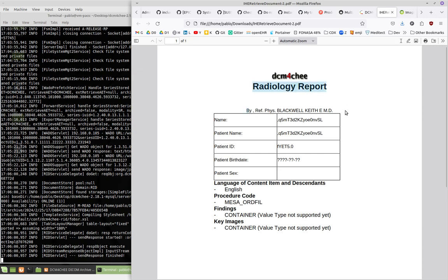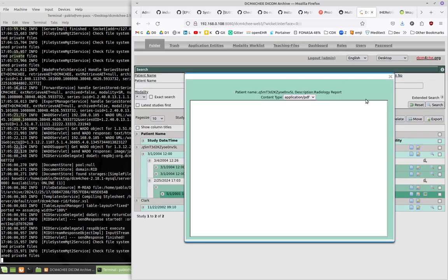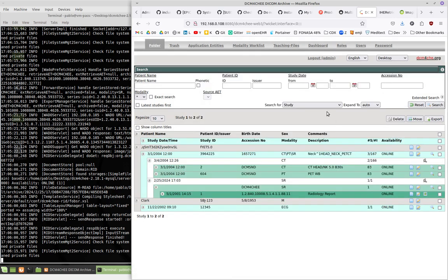This is information on the structure reports, I guess. I'm looking for that. I don't see this name, but maybe this doctor was on the original study, I think. Let's check that.